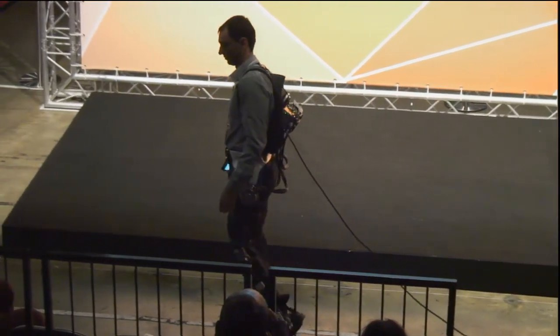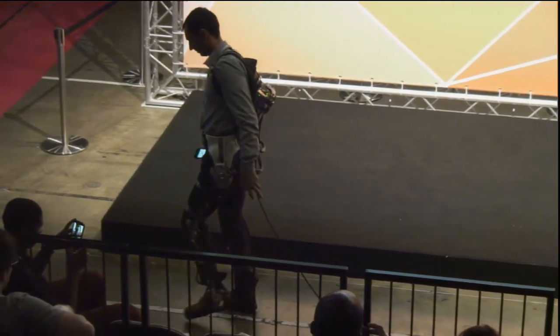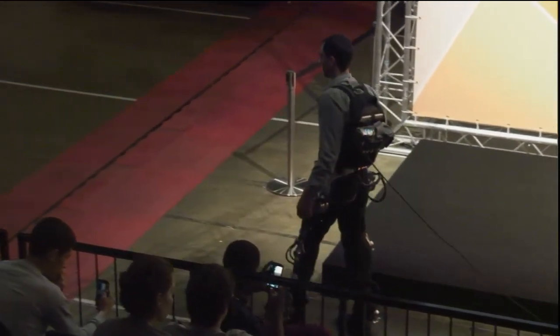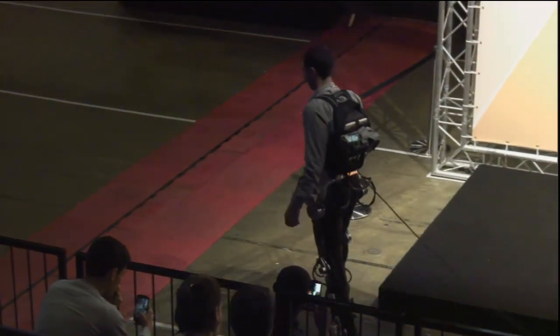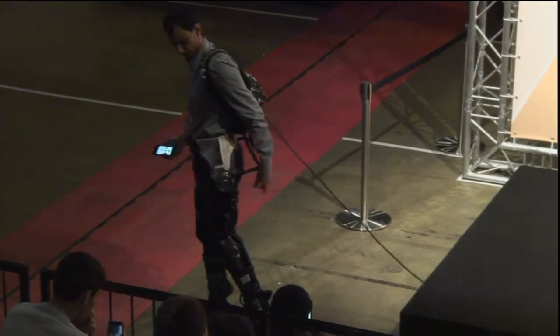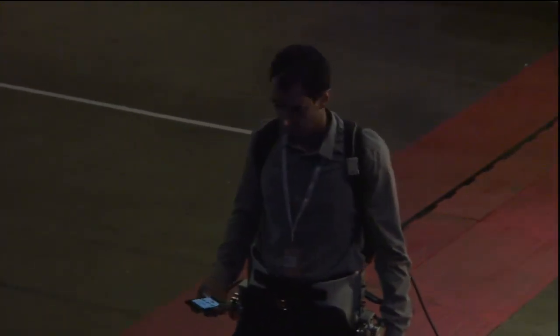So what you see now here is the exoskeleton that I was talking about during my presentation. You have the 6 degrees of freedom. There is a pre-programmed gait pattern corresponding to one gait cycle that is being repeated. So can you come here to the stage?